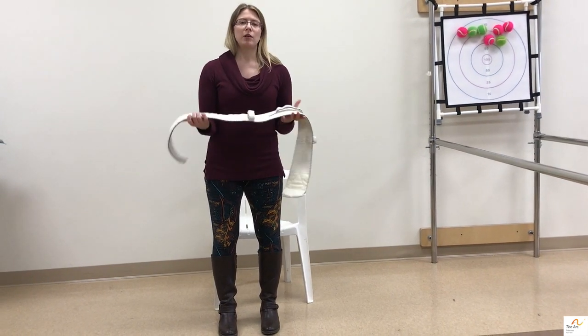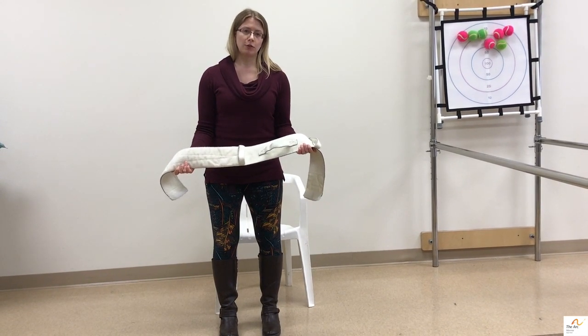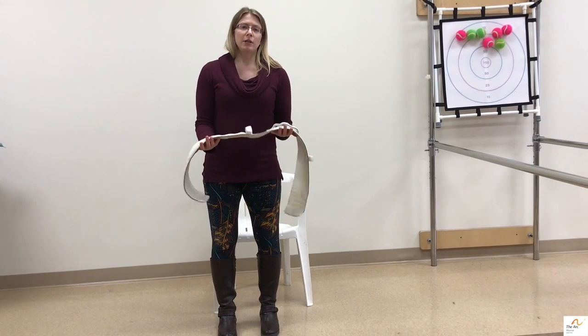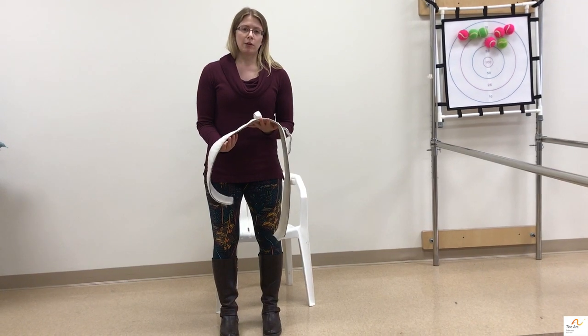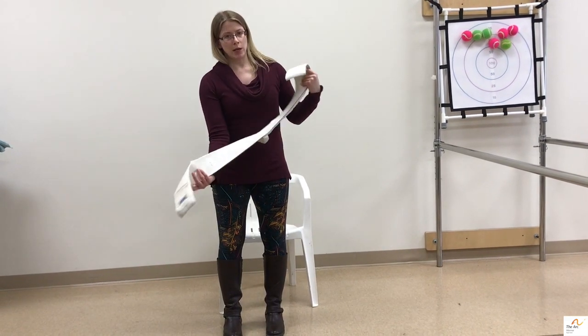The purpose of a gait belt is to assist someone while they are ambulating or transferring from one surface to another. The gait belt allows you to have better control over their center of mass, which is located right here on their hips, and keep them safe and steady while they're ambulating or transferring.